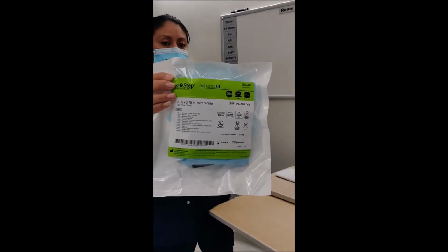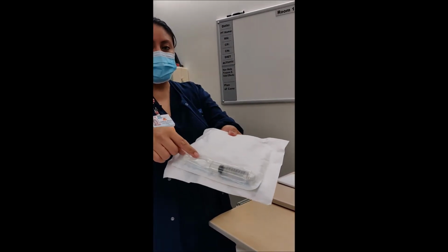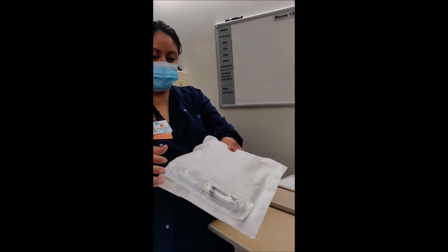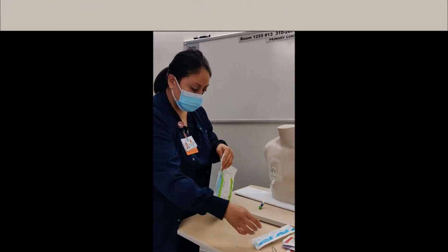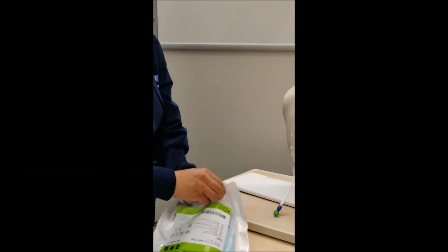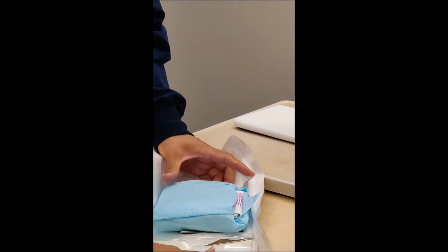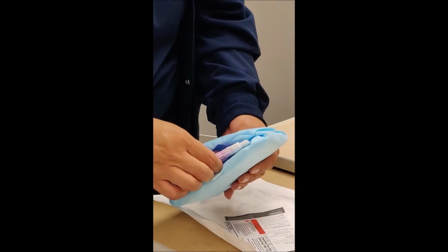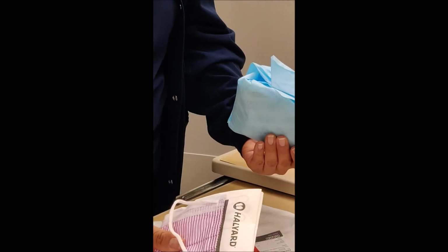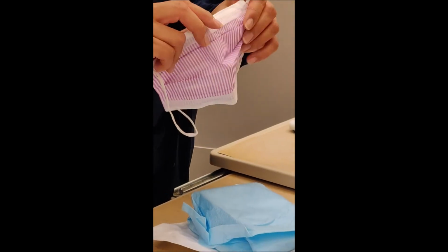The other thing we need too is our Cath access kit, and then this we can get from Center Supply. It actually has everything there that you will need. It also comes with a flush too on the back as well, so it makes it easy. So then we would pull this out from here, open it, and then right when you open it, you are going to see that there is a mask here and gloves. So we don the mask, and then we would also give a mask to our patient as well.